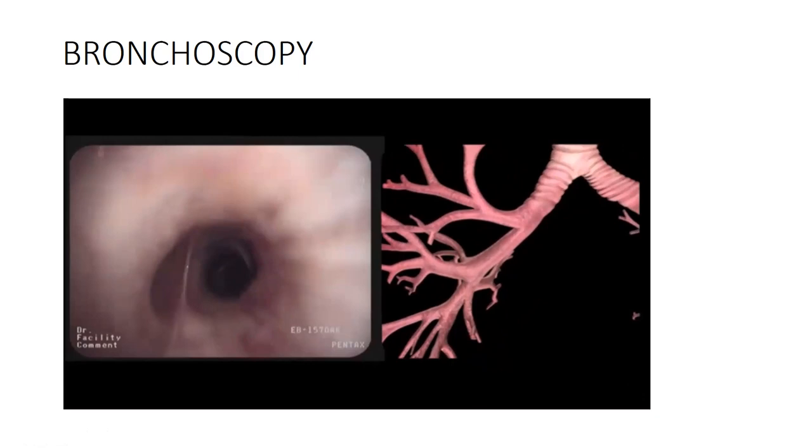That's all. Beyond which, if you want to do a biopsy from a tumor or a lesion in the lung parenchyma, you need endobronchial ultrasound and ultrasound-guided transbronchial biopsy. You definitely need ultrasound guidance because the pulmonary artery and vein will be around the segmental bronchus. You can't blindly puncture through the bronchus. Continue. Go on.